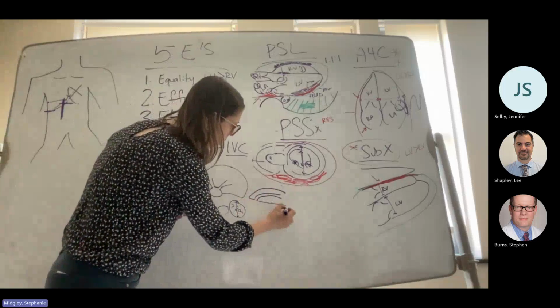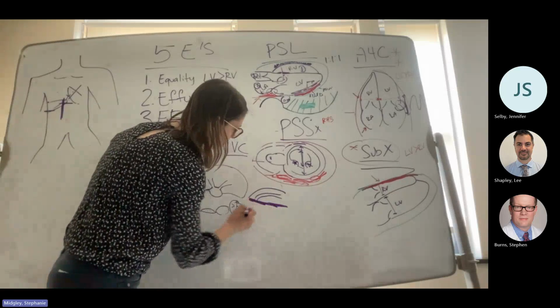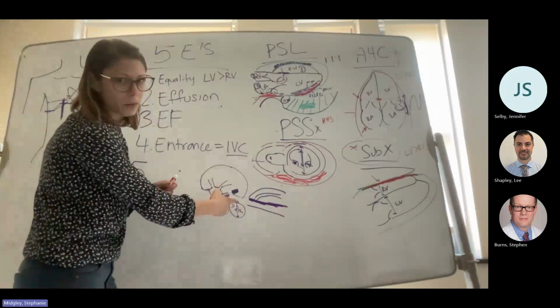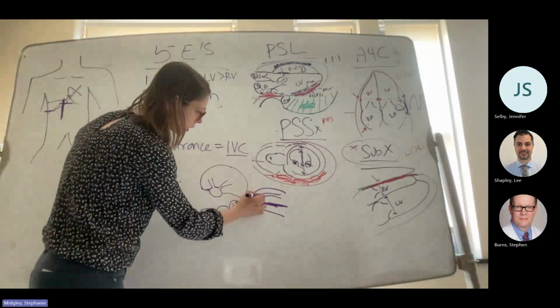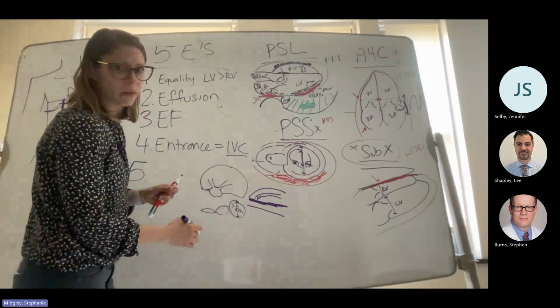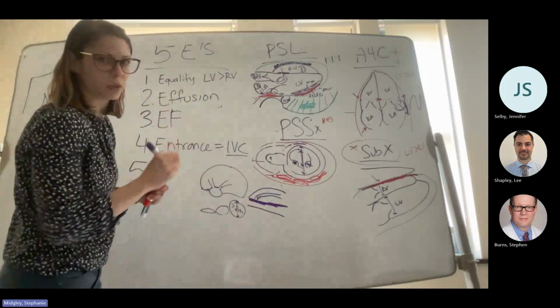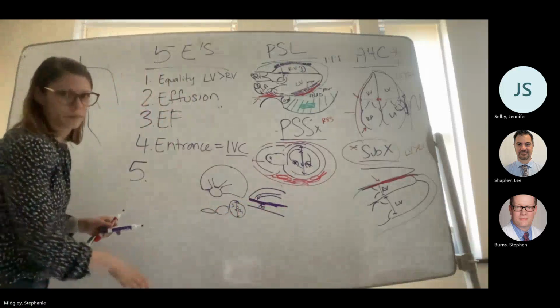If I have my aorta, there's a little separation between it. But my aorta goes through my diaphragm as well, right? So I can't use going through the diaphragm as my marker. Really what I'm looking at is, is my hepatic vein draining into it? And is it going through my liver or is there a slight separation? Slight separation, this is aorta. Okay.